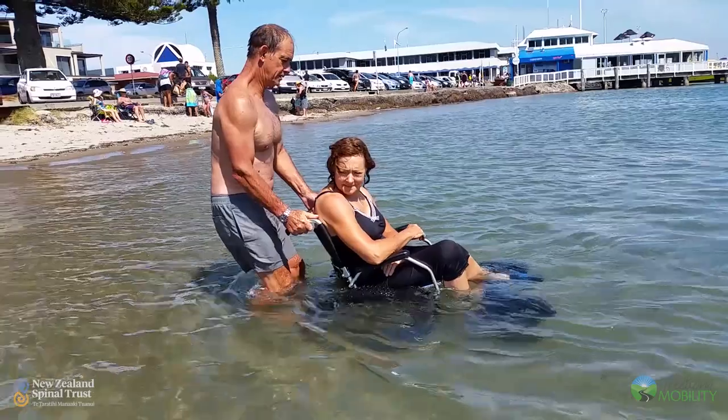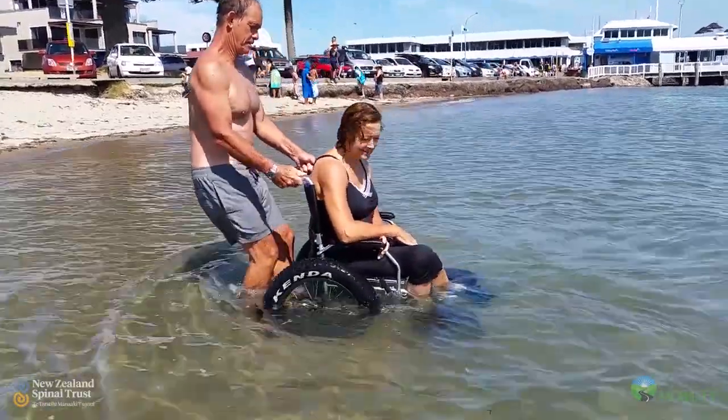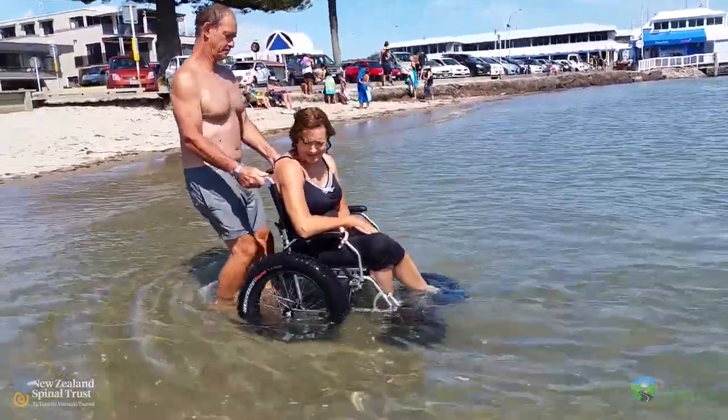Once Frank put all this together and he and I went to the beach and tried it out, it just changed my whole life. It changed my whole outlook.